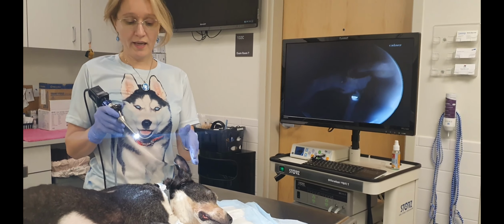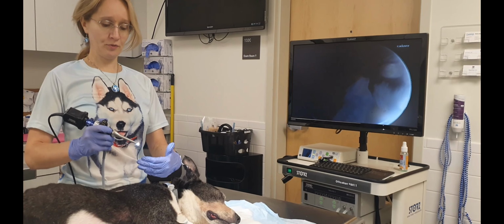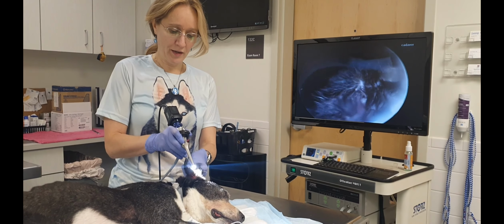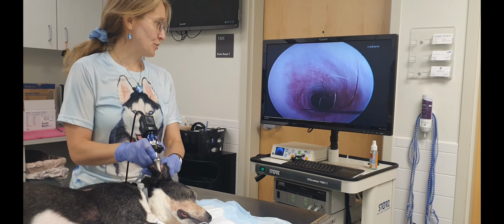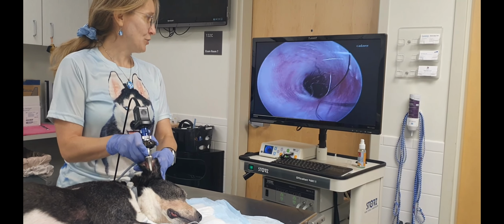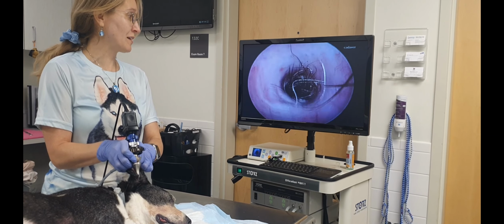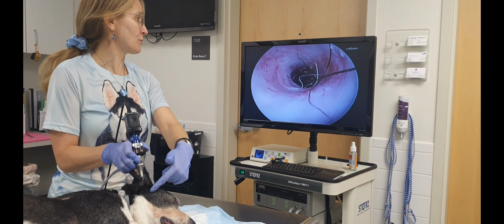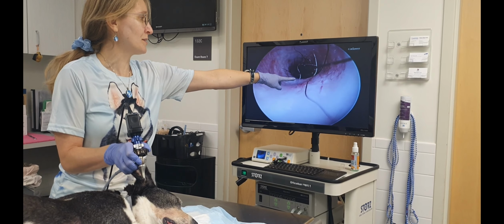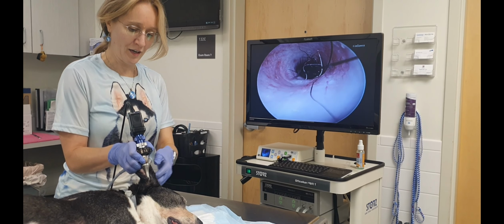And now the same lateral position, but you are standing on the dorsal side of the patient. In this way, everything you are going to see on the screen will be upside down. So you have a little bit of a weird way to go inside, because you might not be accustomed to this view, but whatever is on the top is actually the ventral part of the ear canal. Whatever is on the bottom is actually the dorsal part of the ear canal. The same with rostral and caudal.